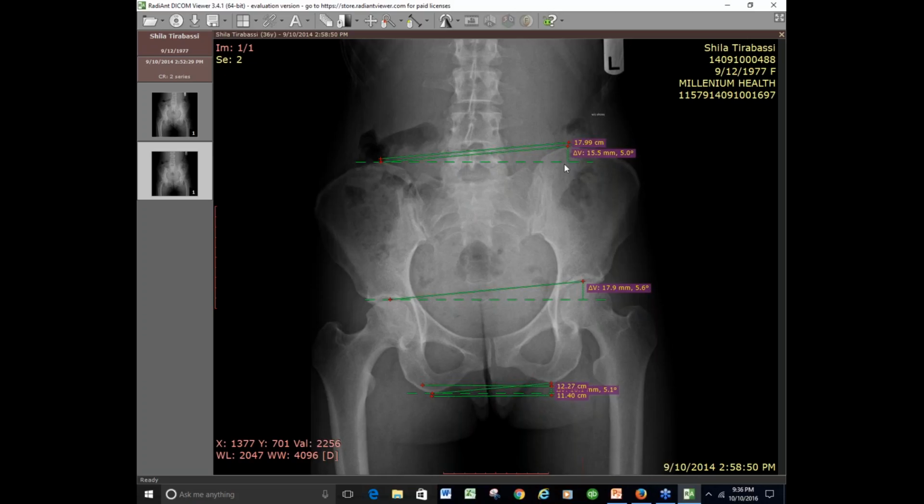Hand calculation for X pelvis. Okay. So yeah, there certainly is a calculation that you can do for that, and we will get that to you because it is a ratio. You're going to have to figure out a ratio to figure that out, but I will definitely get that to you. Thank you. You're welcome.